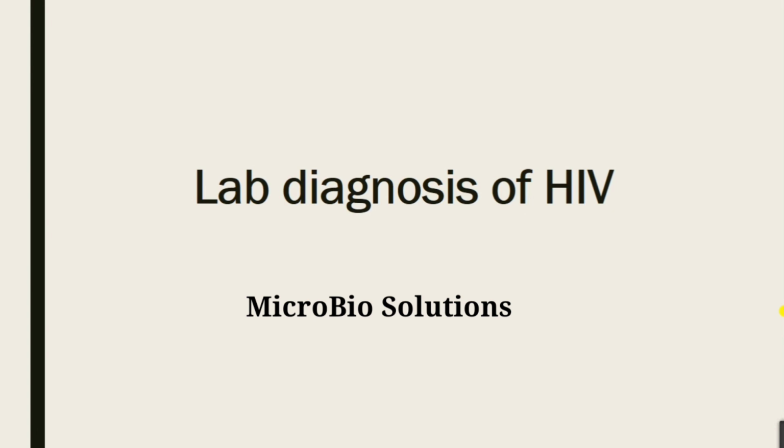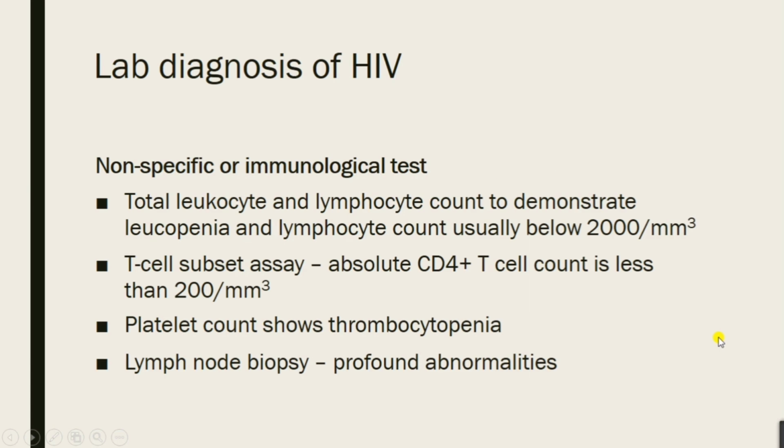Today we are discussing laboratory diagnosis of HIV infection. There are different types of tests available for the lab diagnosis of HIV. One is the specific test and the other is the non-specific or immunological test.